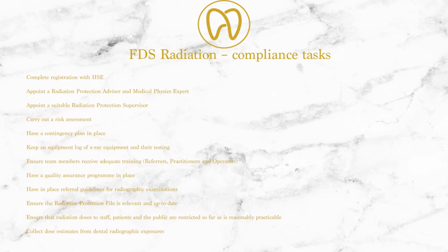All doses are kept to a minimum. You can find the settings that are recommended in the radiation protection file, but they are set as standard on the equipment, which is user friendly. And the number of dental x-rays is recorded because it's recorded through the practice management software.